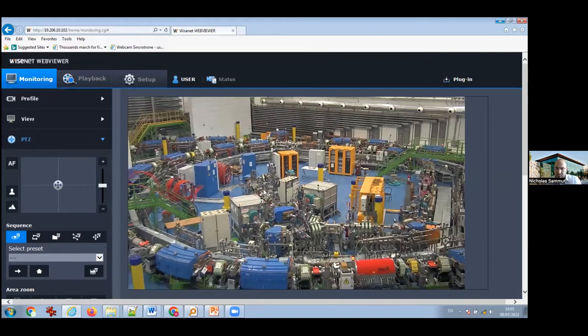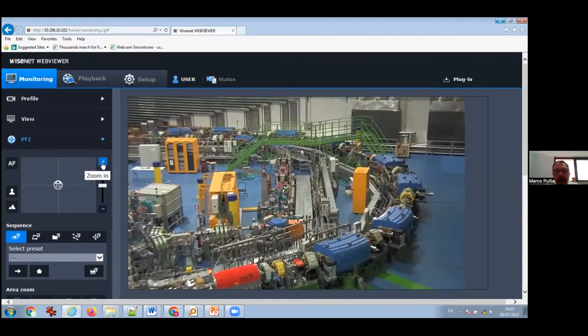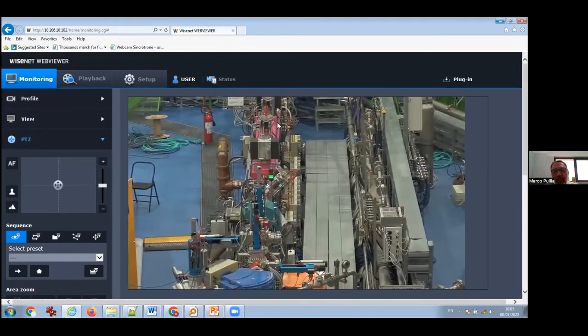And then the beam coming from each of the sources is transported in a standard magnetic channel until this part here. You see, we have this pink object here, which is our LINAC. Just upstream of the LINAC, we have the RFQ. Here you can see a green solenoid as well.